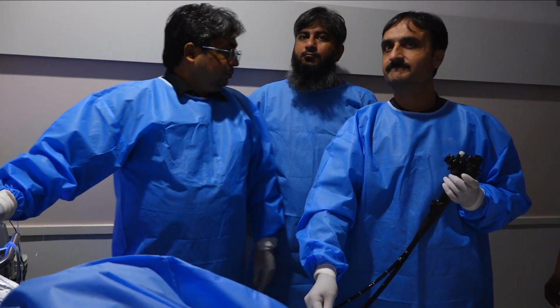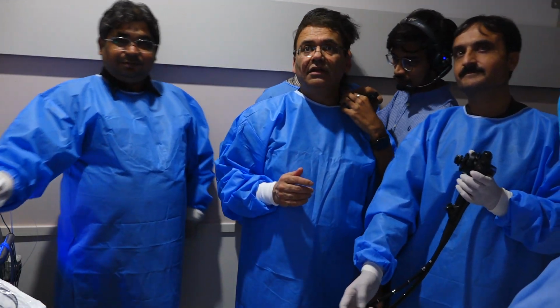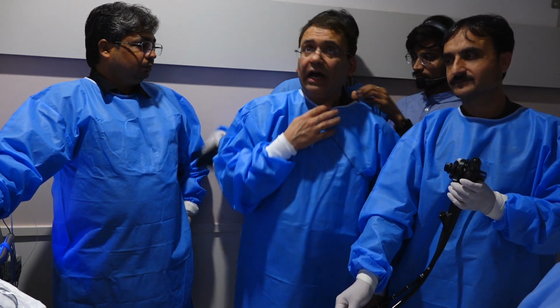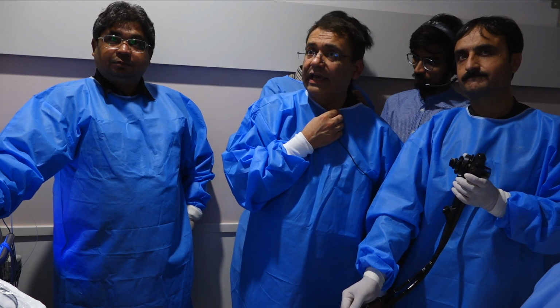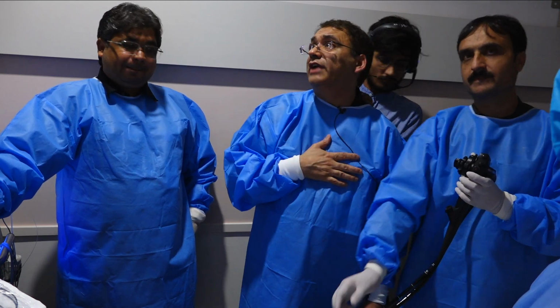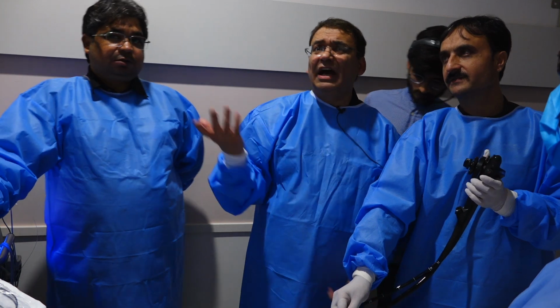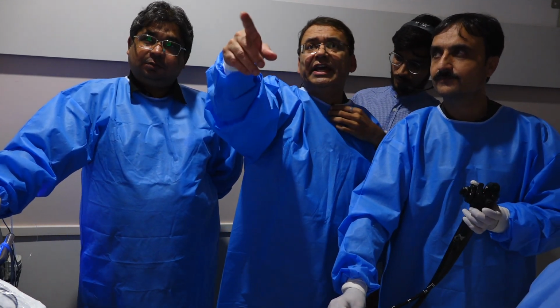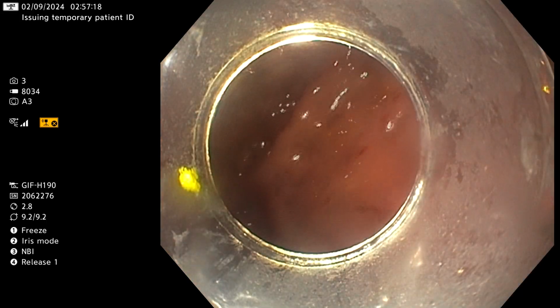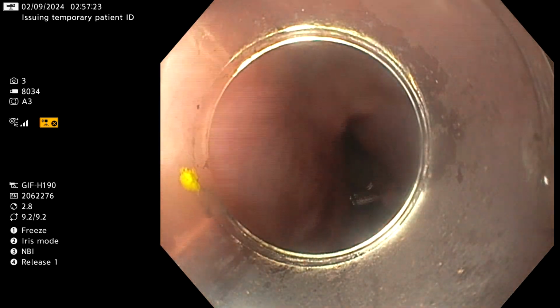Okay, so you're just showing, please close the thing, it's all done. Okay, Khalid, we're just back with you just to see. You've closed the thing and... can you hear me? Yeah, it took you 25 minutes. Can you hear me? Yes, we can hear you and we can see you. Oh, okay. We already closed at 2. Yeah, I know. You took about what, 25 minutes? I think we are done. It's pretty open, easily going all the way. Yeah, we can see it well. Okay Khalid, as usual, you're unbelievable. Thank you. Go back to Mustafa, please.